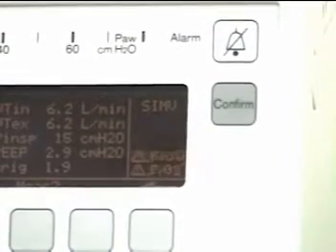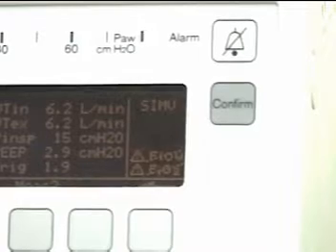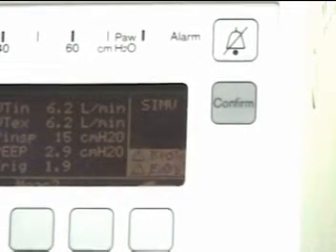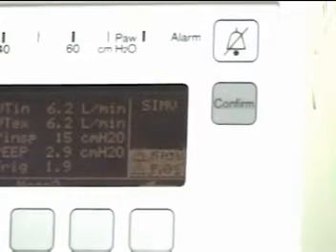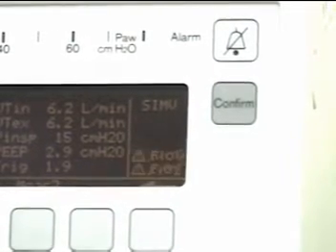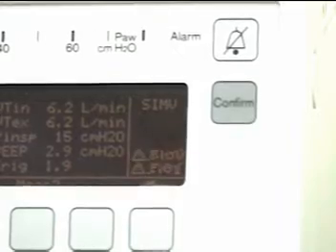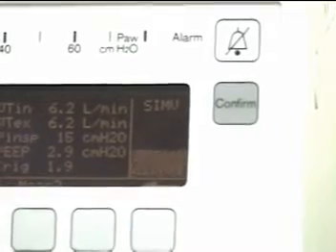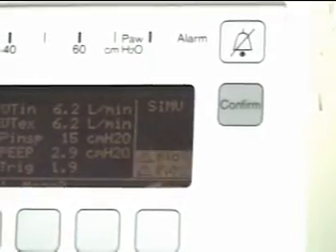You'll notice that the FiO2 is flashing at the moment. That's because we are powering this ventilator with 100% compressed air.